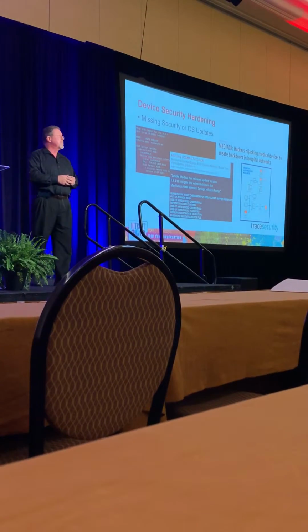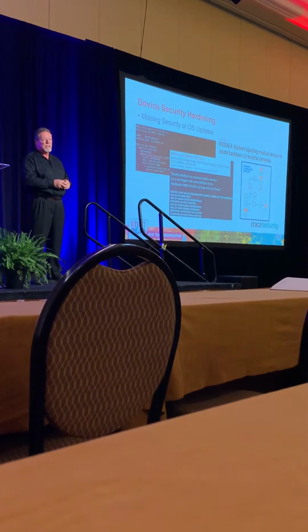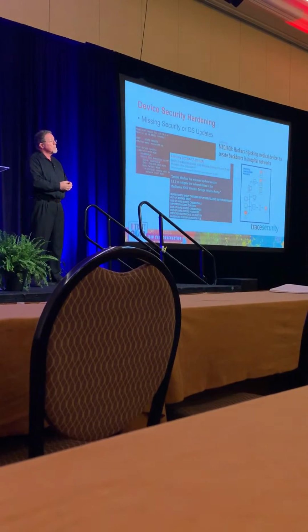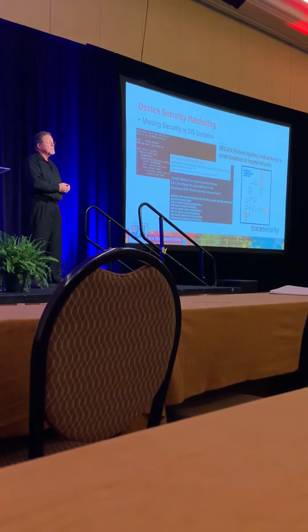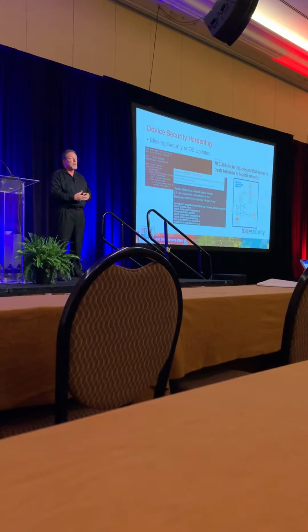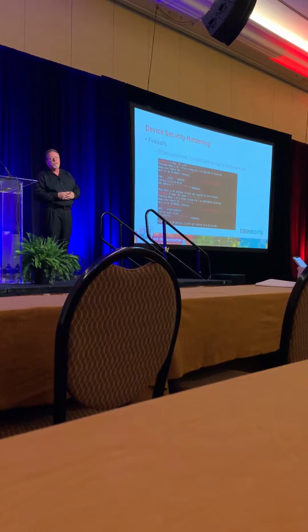We talked about operating system updates. Security flaws are found all the time, just like Microsoft just discovered a flaw that had not previously been known. The first step is, of course, knowing that all of the security patches have been applied prior to a system or device being deployed, but also then to maintain an ongoing patch management process.